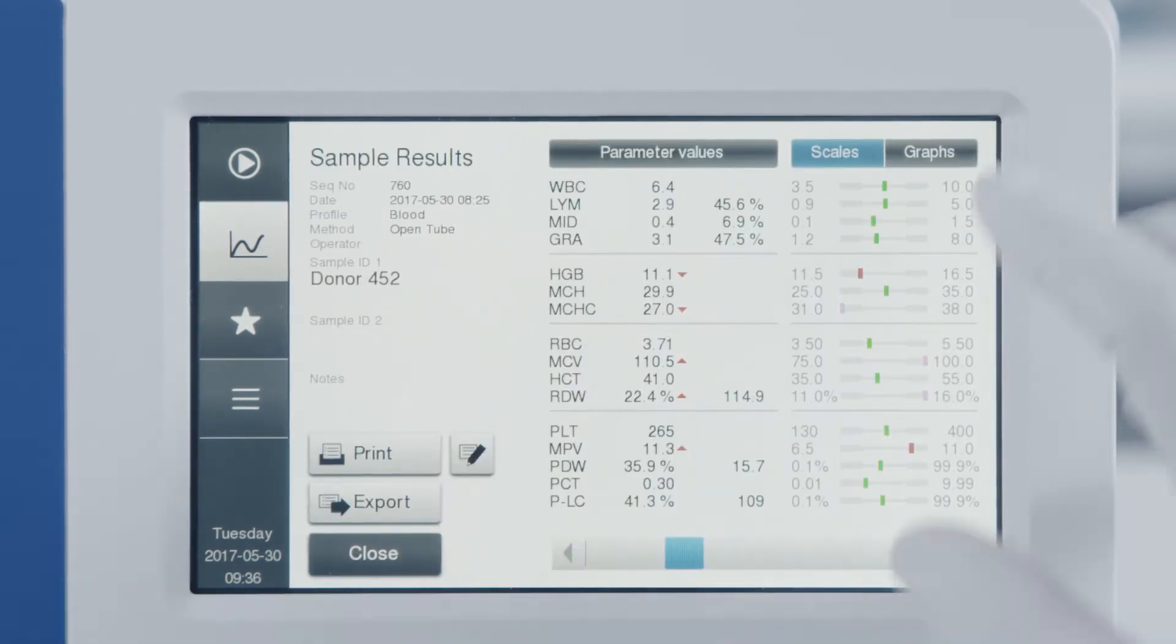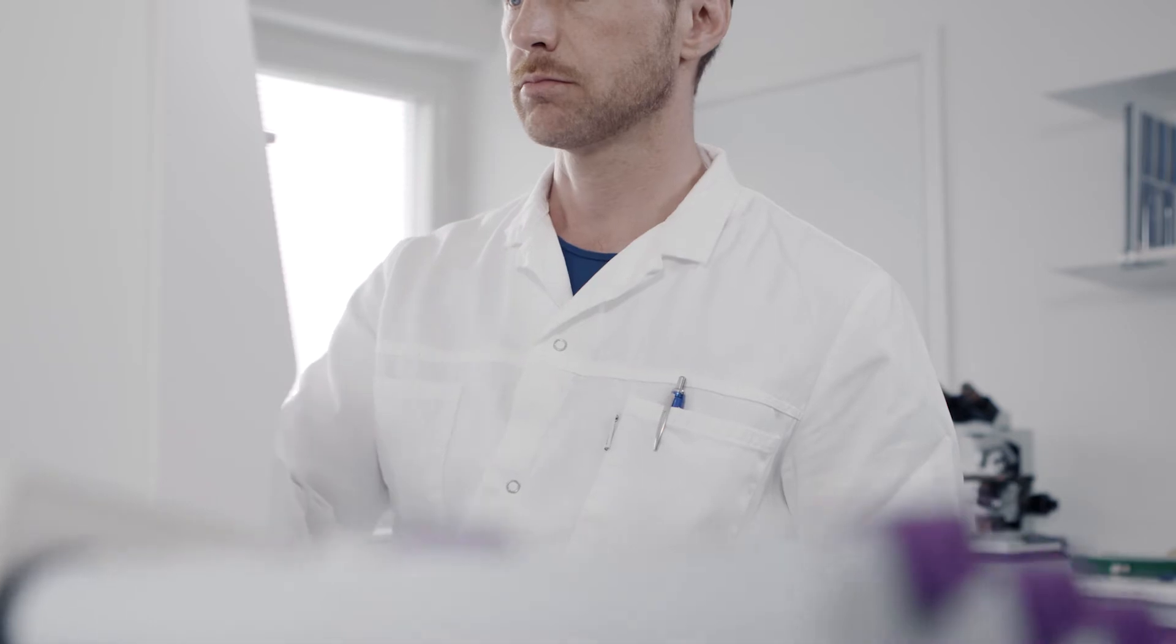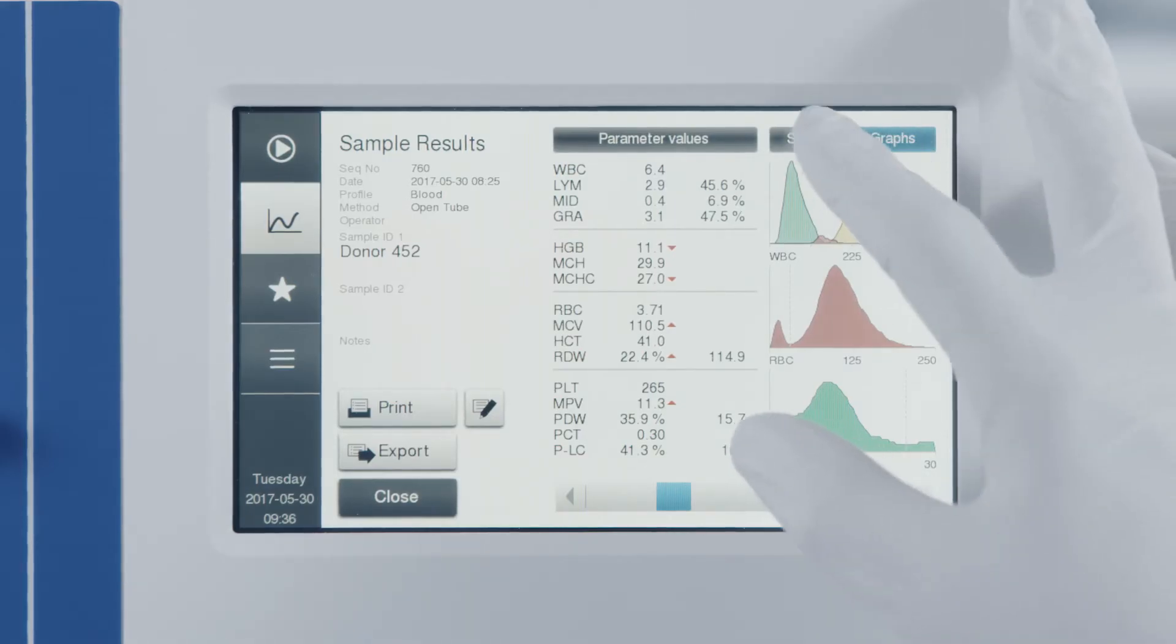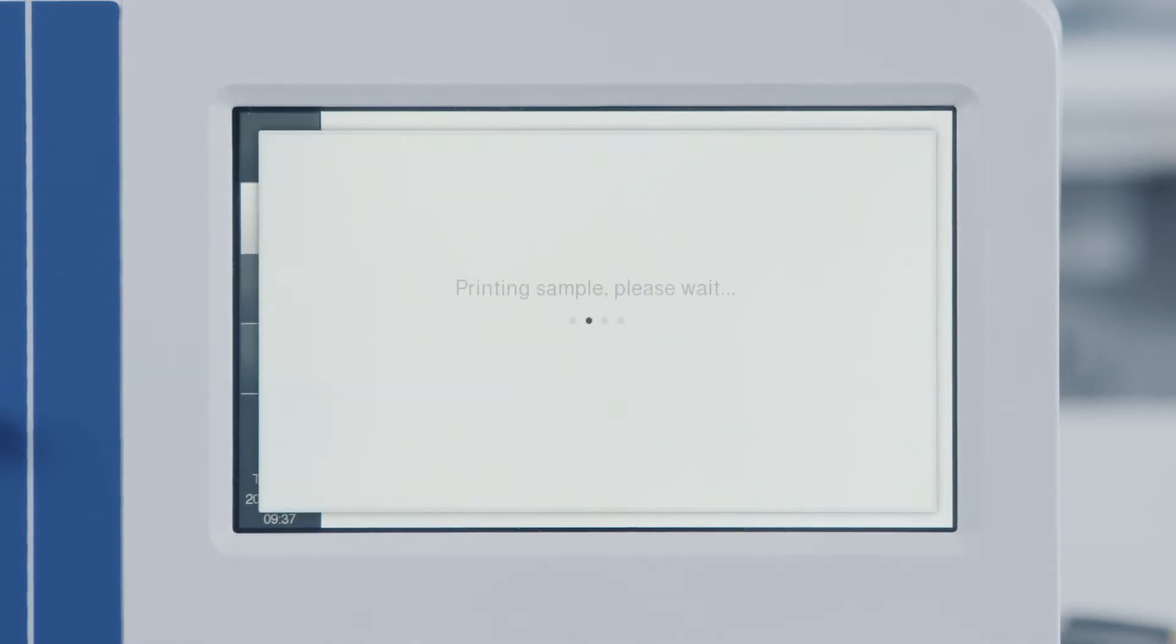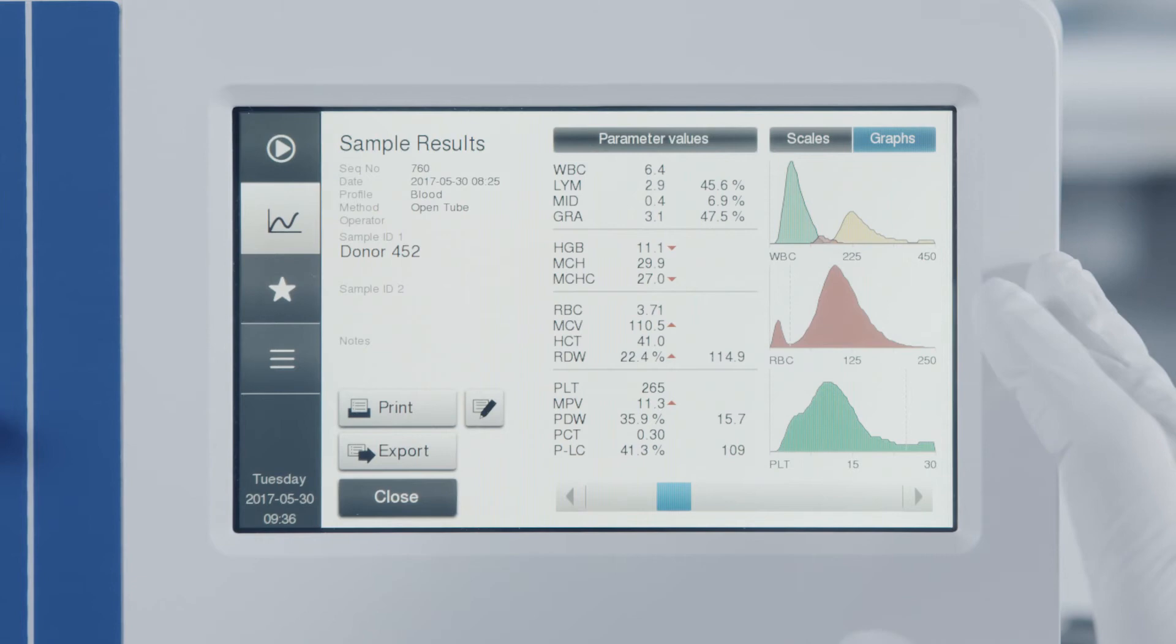Madonic M32 also keeps your options open about how you view results. Choose between histogram or reference scale views, for example. Printouts are fully customizable as well and cover any or all of the parameters you choose to display.